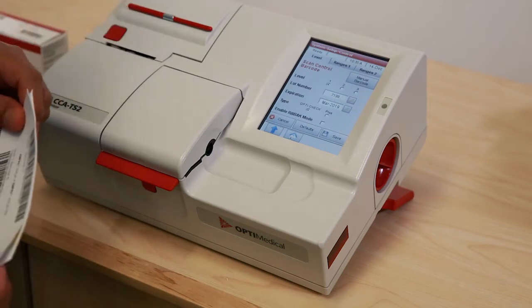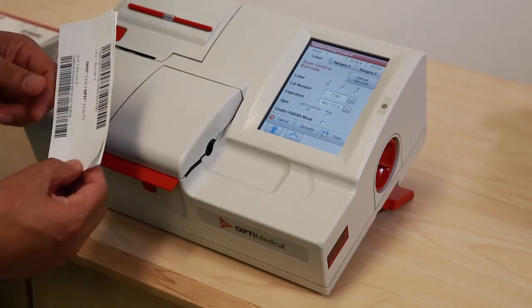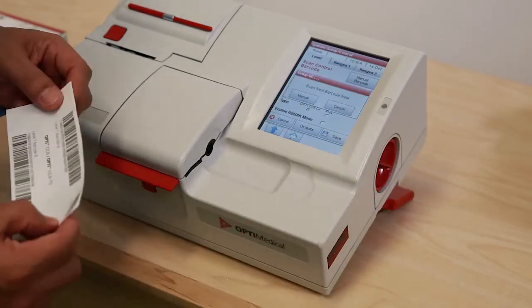Under Control, the analyzer indicates the user should scan the control barcode. The insert from the OptiCheck box has to be scanned on the barcode reader, and the full light has to cover the barcode.